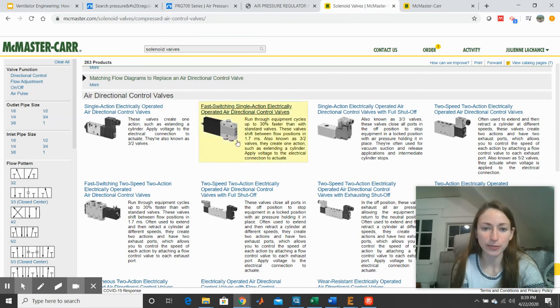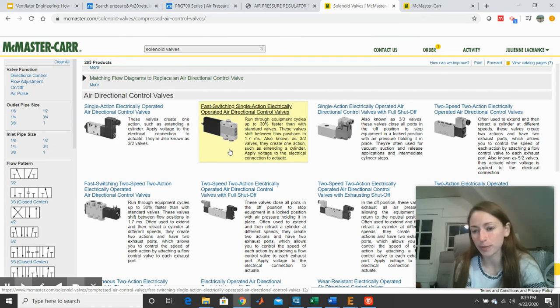But immediately I noticed the difference between single action control valves and two action. The difference between these is that the single action valve typically has a spring within it. So it's either normally open or normally closed. You actuate it to put it into the other state, and then a spring will switch it back to the original condition. The two action control valves actually have two independent control modules to flip back and forth between the two states. So I know from experience that looking through these valves, the McMaster two action control valves don't actually tend to be that much faster than the single action valves. So I'm going to look at this fast switching single action control valve section first if I'm doing part spec'ing.